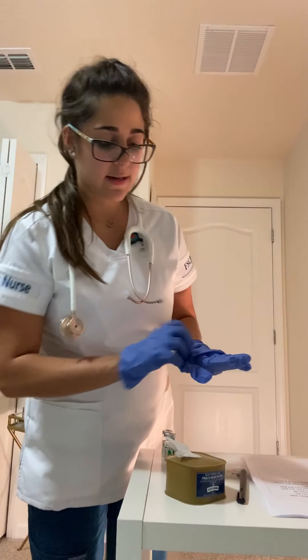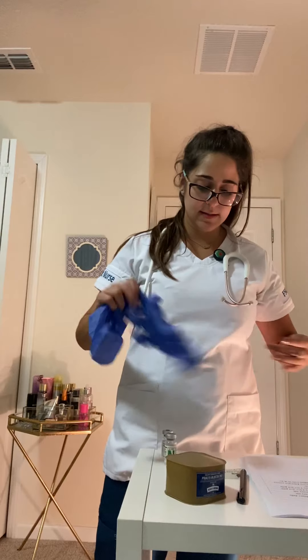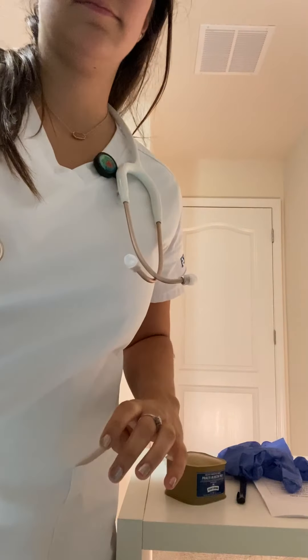I'm going to palpate and inspect for any bruising or tenderness that might have happened. I'm going to lower the bed, raise the side rails, and give my patient back their belongings. I'm going to ask them what their pain level is. And that's all — wash my hands and clean up my area.